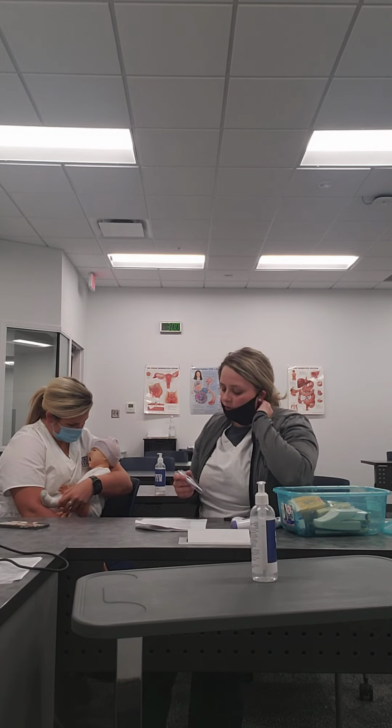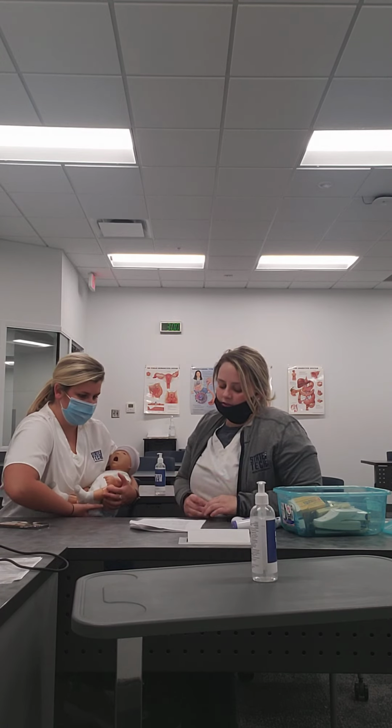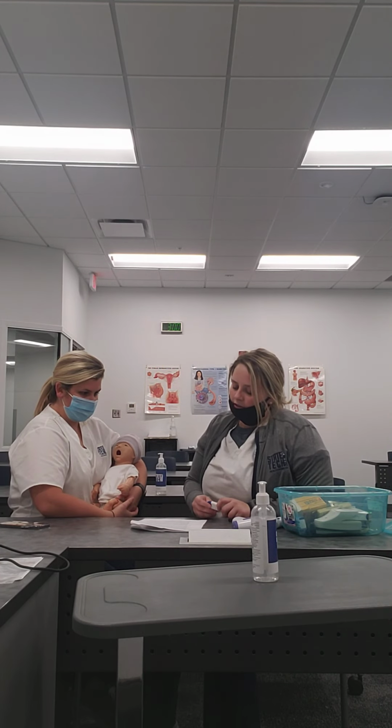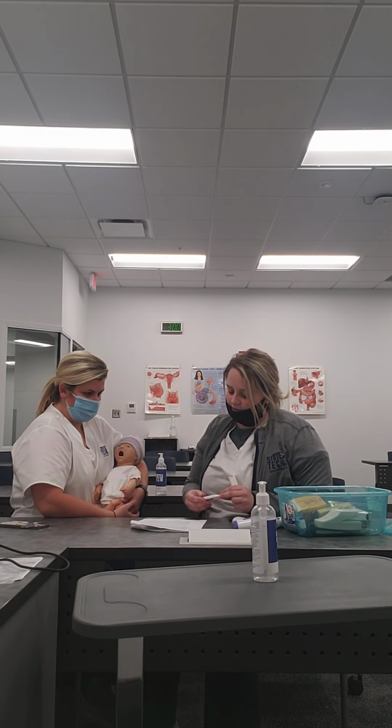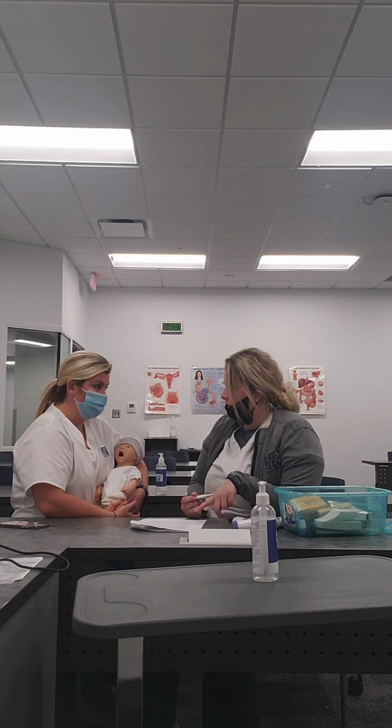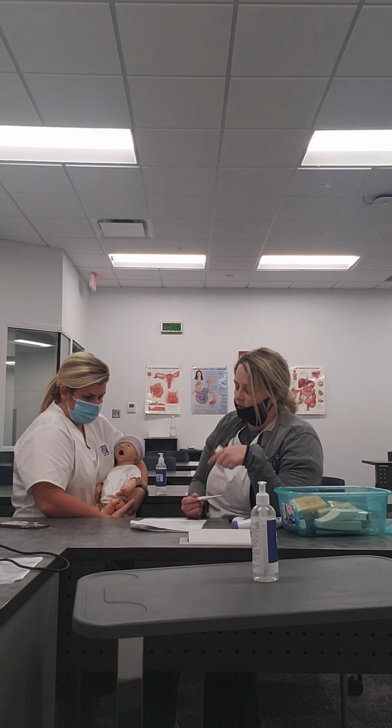So now we're gonna go over how to take a temperature with each route. So we're not gonna actually do all of these. The ones we'll probably do are the oral and the armpit, just because I don't want to upset Jacob with the rectal. Yeah. So we're just gonna go over the rectal. So let me get my rectal thermometer. So to do this, we're gonna turn on the digital thermometer. And then this is where you lubricate. They suggest petroleum jelly, something like that.